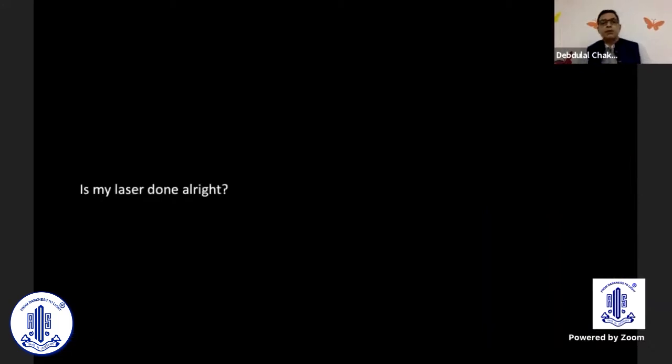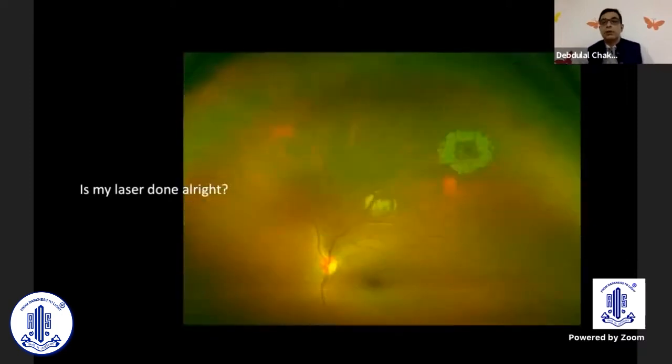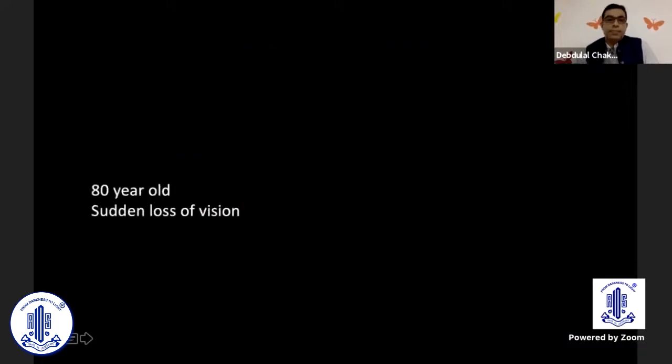There are a lot of patients who come to me asking whether my laser has been done all right. So the Optos says it all. And you can save a colleague from other issues by showing that the laser has been done all right.